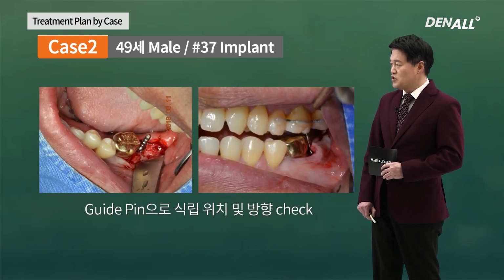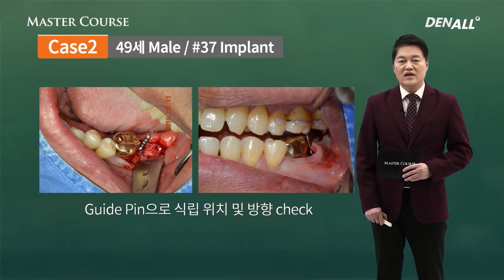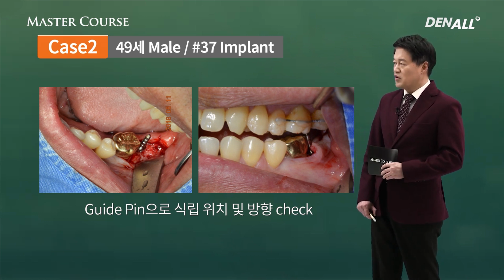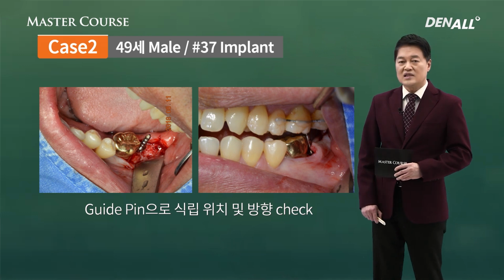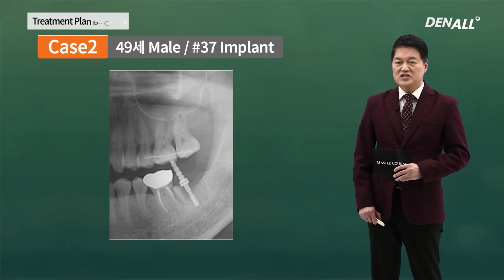Use guide pin to check the placement, position, and direction. Check the occlusion and check whether it heads towards the functional cusp of the other arch. And mesiodistally, check the position and take an X-ray for this.